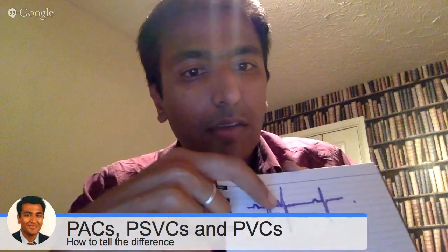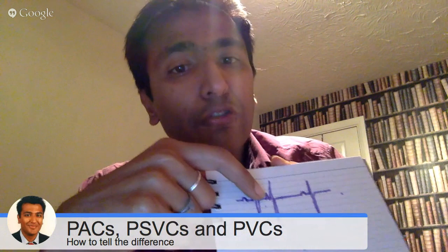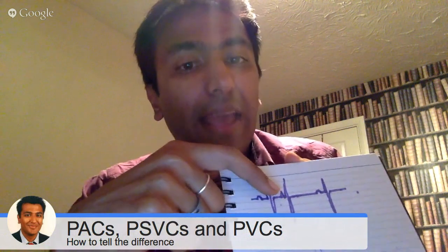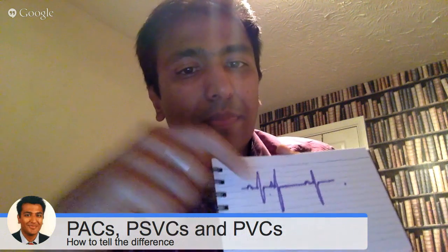Can you see this little notch? This P wave is different from this P wave. So it tells me that the impulse is still being produced in the atria, but not in the normal pacemaker. So I would call this a premature atrial complex, a PAC, because there's a P wave. And so I know it's coming from the atrium, okay?